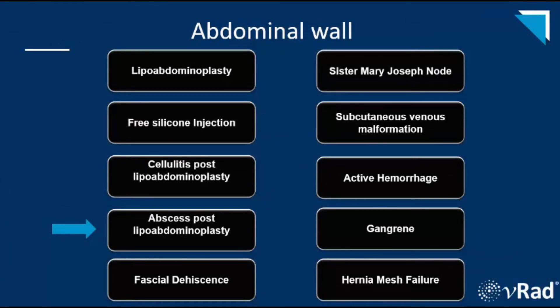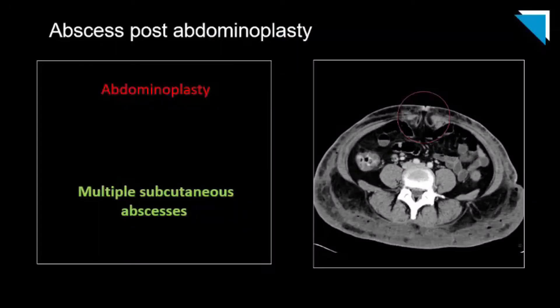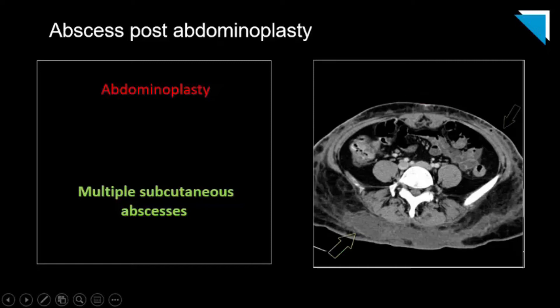Our next case is abscess following lipoabdominoplasty. On a single axial slice from a contrast-enhanced CT, we see evidence of a prior abdominoplasty with the typical crowding of the rectus muscles in the midline. As we move further down, we see multiple peripherally enhancing fluid collections which contain foci of air, compatible with abscesses. Anteriorly, we see the smaller collection overlying the left iliac crest at the site of the ventral incision, and posteriorly along the liposuction cannula track, a larger abscess.